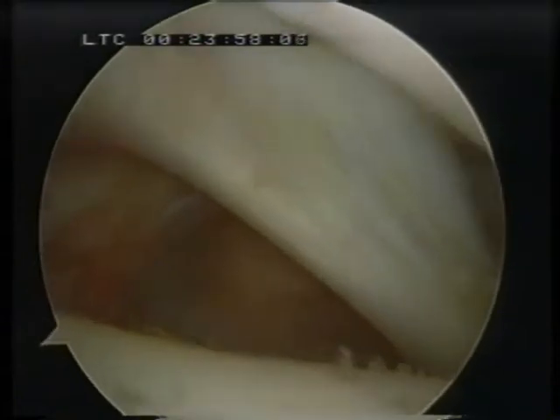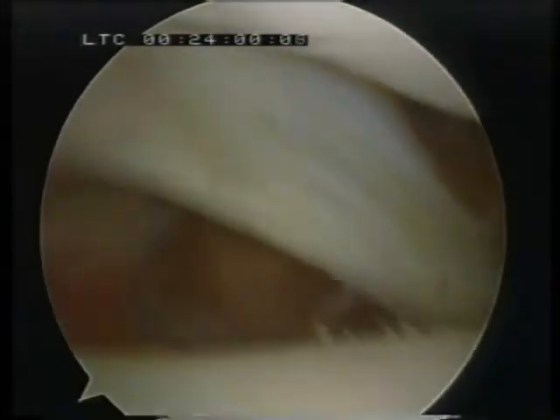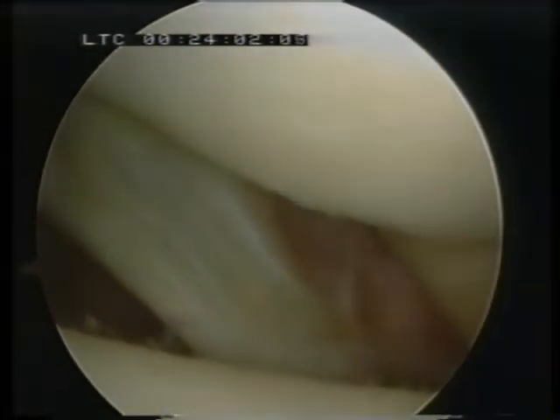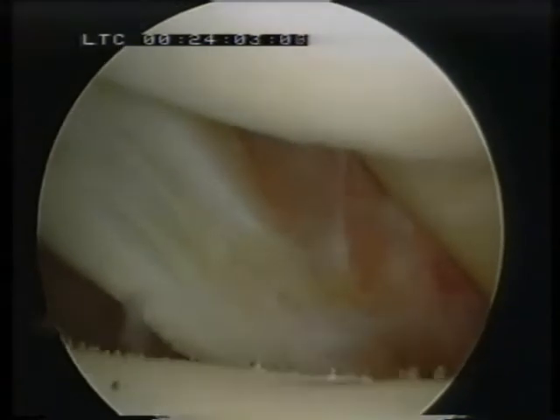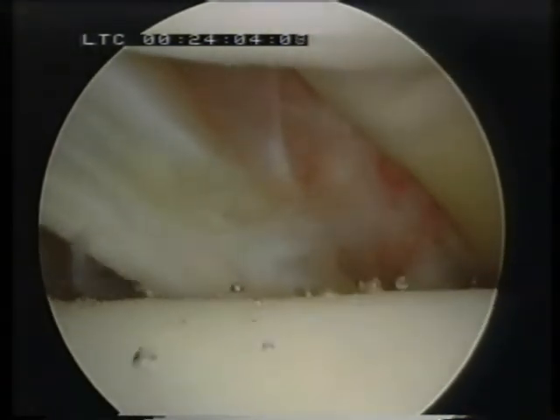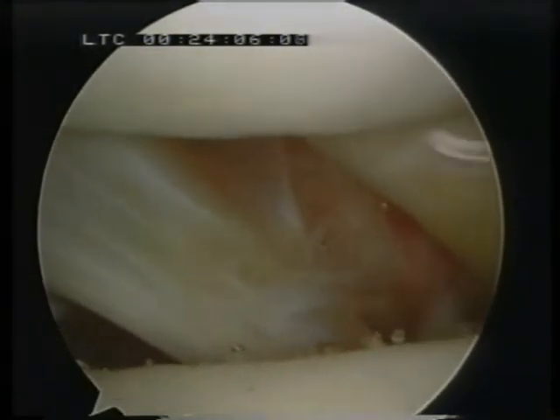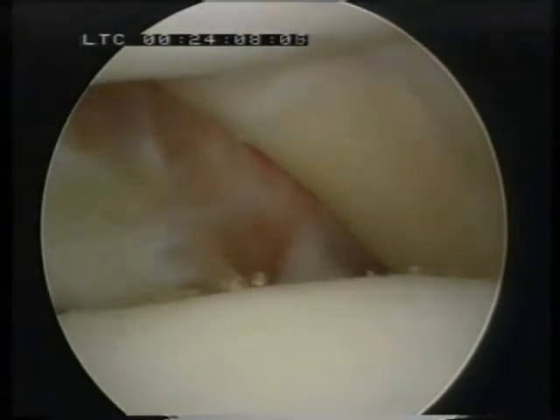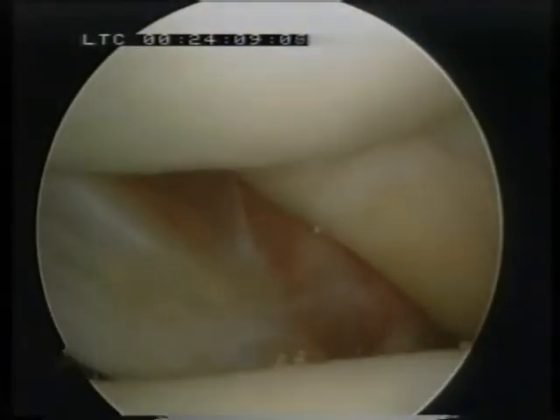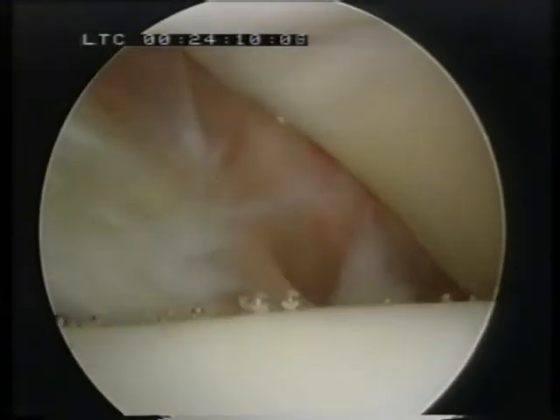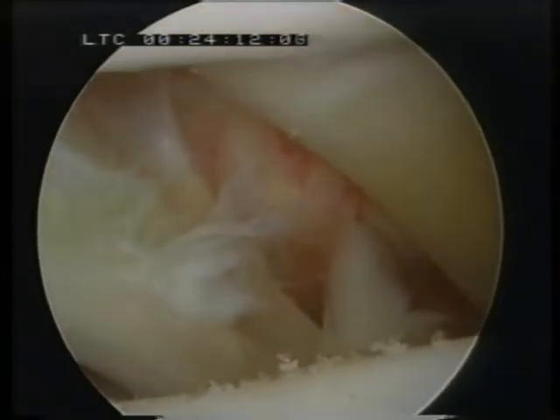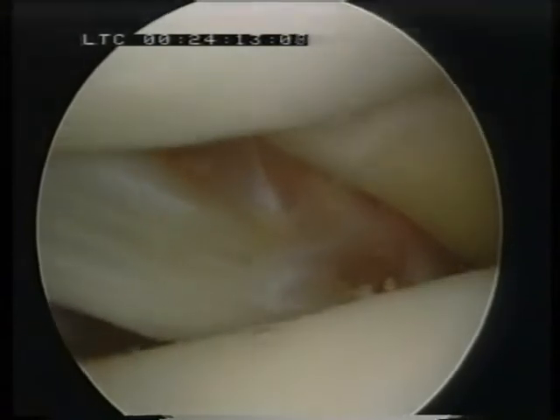Looking at the back there, you can see the posterior transverse tibiofibular ligament, and you can see some fraying with that, which is often a finding with chronic sprain syndrome of the ankle. At the back there, you can see some synovitis and some further fraying of the ligament.